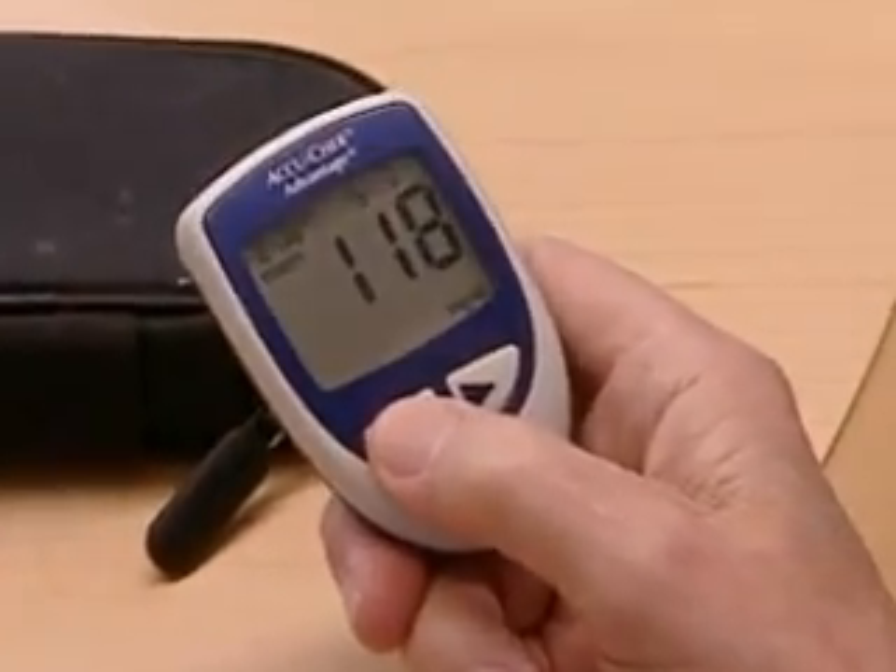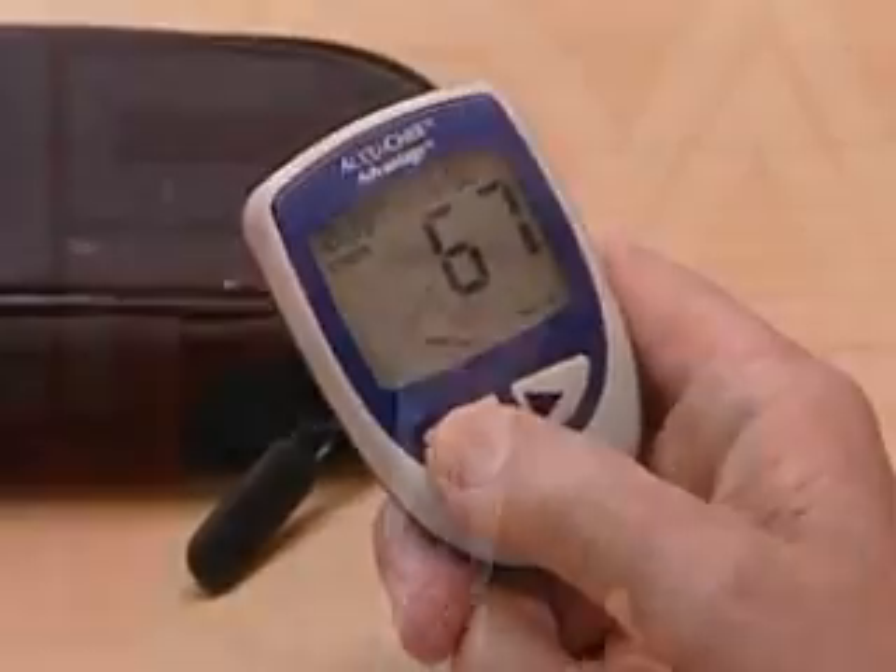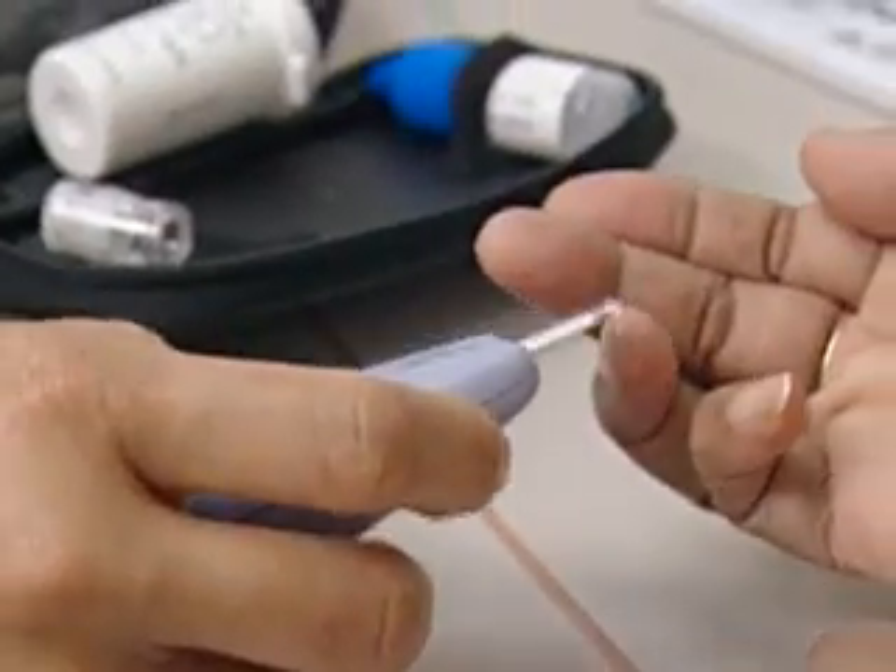Glucose meters are generally reliable, but they're not as accurate as the testing that's done in your doctor's office. So take your meter with you when you visit your doctor so you can compare it with your laboratory results.